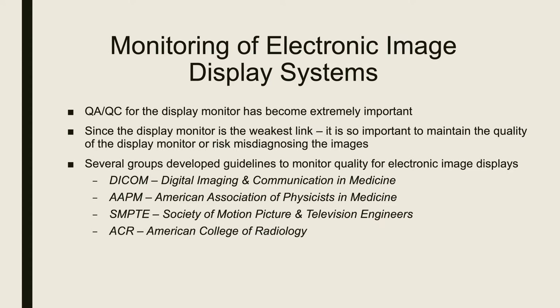Now we're going to move on to monitoring the display systems. So there's a QA and QC, as you can imagine, for the display monitor. This has become extremely important because the radiologists read from the monitor. Since the display monitor is the weakest link, it's important to maintain quality. Otherwise, you risk misdiagnosing the images.